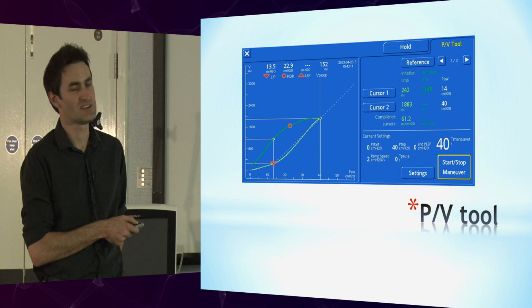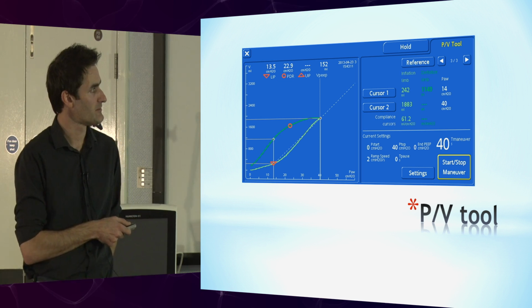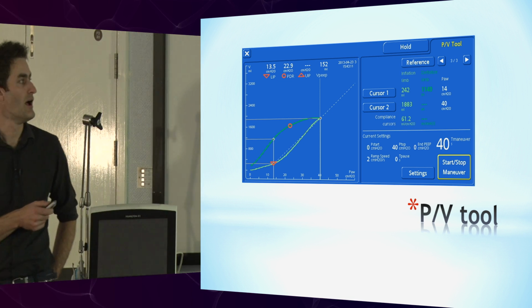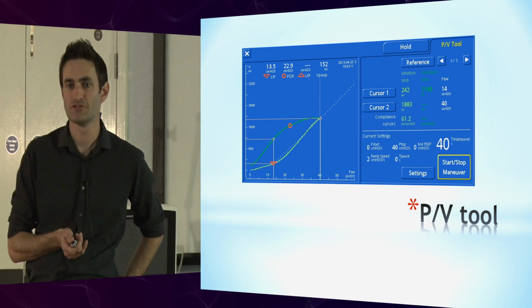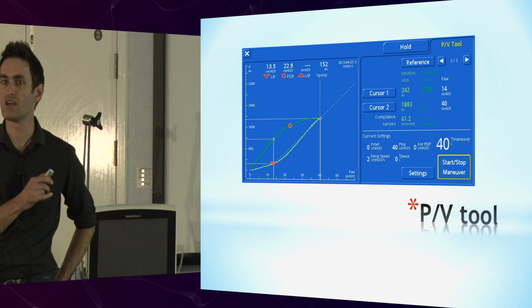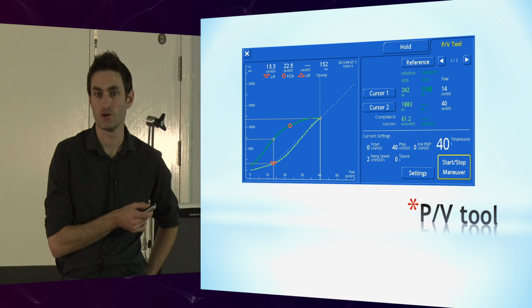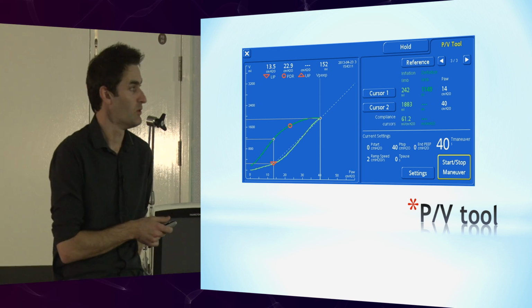Go up to 40 slowly to open the lung up, and then come back down again. There are 3 measures that you can use with this tool to assess whether or not that lung is recruitable. And just to reiterate, we're going to go through this this afternoon in the workshop, so you're going to get to have a go at this, and we can talk about these numbers again then, okay?